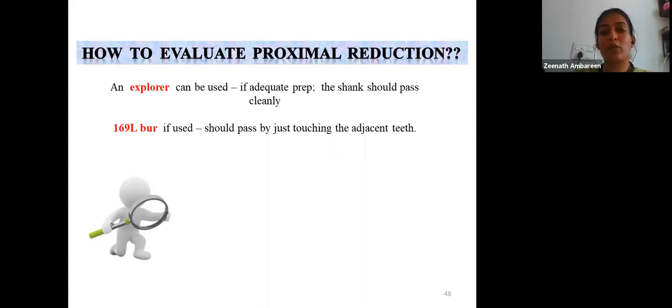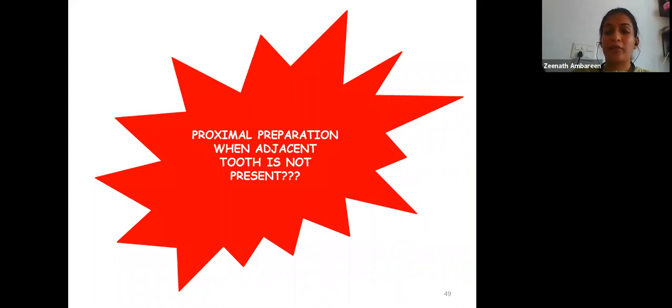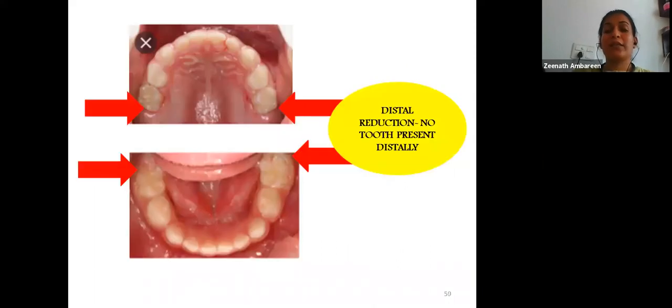Proximal reduction is evaluated with an explorer that should pass easily around the prepared tooth; a bur should pass just touching the adjacent teeth with no proximal ledge. Even when there is no adjacent distal tooth — such as in children with exclusive primary dentition where the first permanent molar has not erupted — distal proximal preparation must still be done. Failure to do so results in selection of an oversized crown, which can later hamper eruption of the first permanent molar.